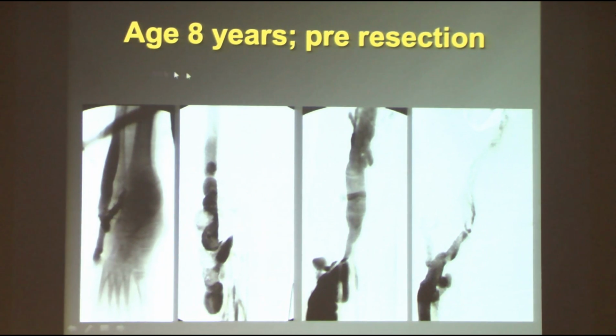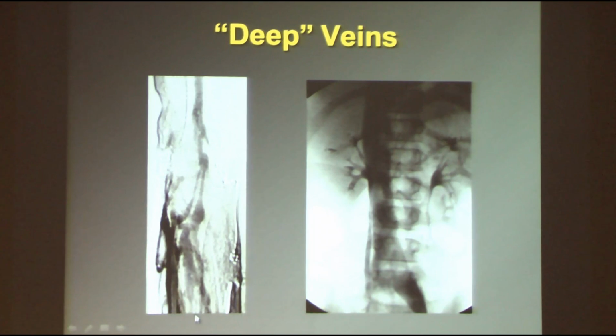but she was operated on. Actually, Steve took out this big marginal vein because we were worried about it clotting and sending pulmonary emboli. And then when we studied her better, we could see there were deep veins. They're not normal, but continue up in her sciatic vein. Look at how big her inferior vena cava is.